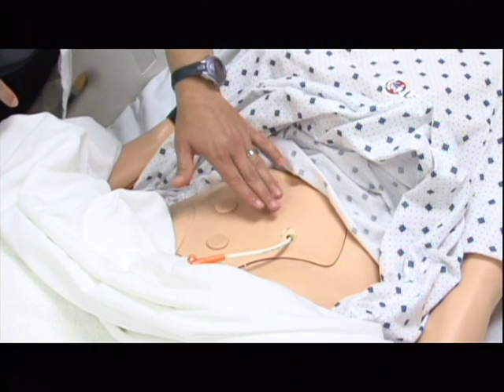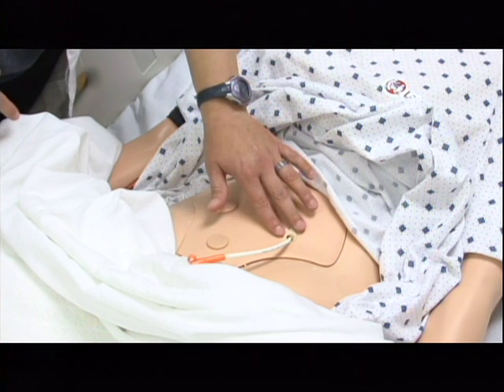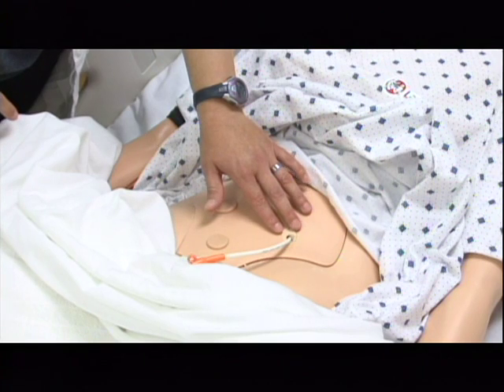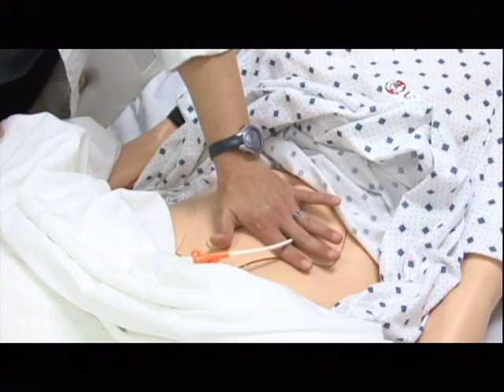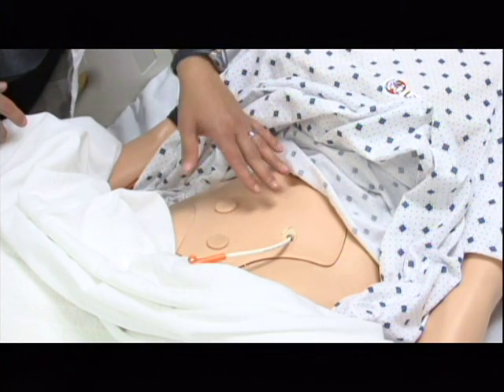Now, if this tube has just been placed, you may well see a suture around it. Tubes that are more established probably are not going to have sutures here to keep them in place. If it's a new tube, you might also see a dressing that is pre-cut that goes around the tube. You may not see that later on. It depends on facility policy.